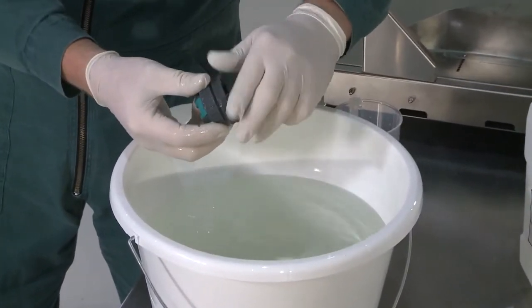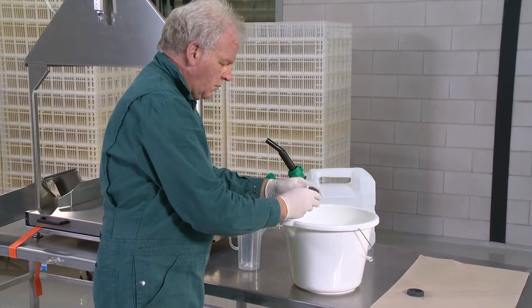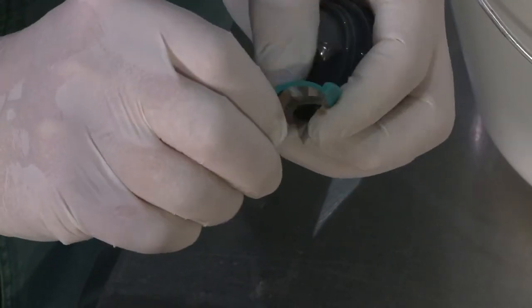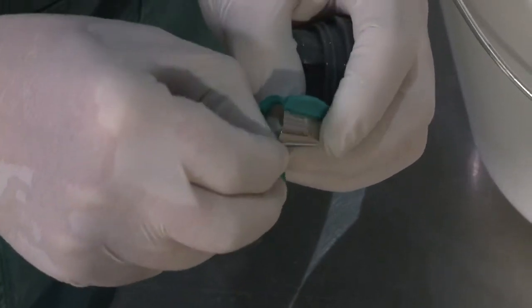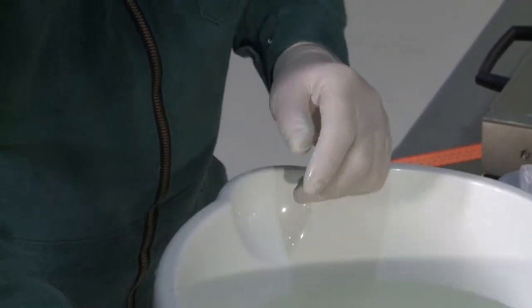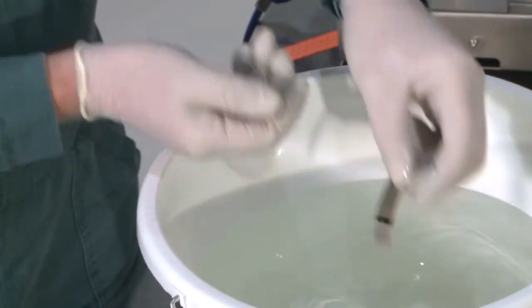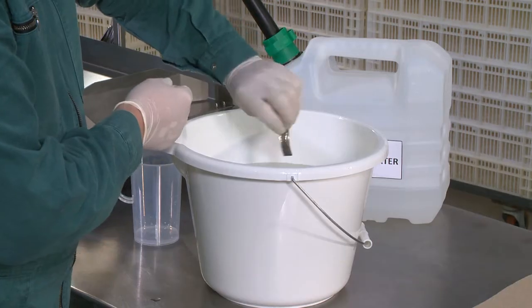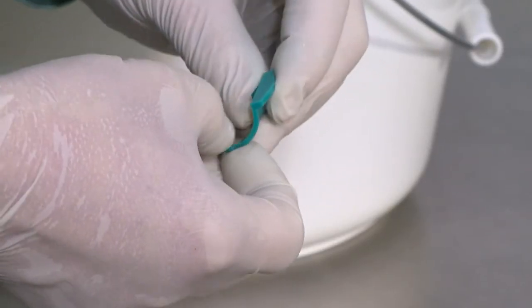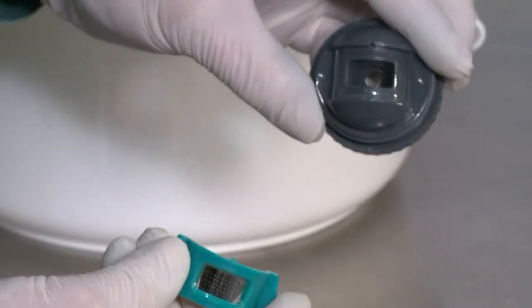To replace or clean the inside of the spray nozzle, unscrew the spray nozzle from the Nobilis spray. Unscrew the cap nut from the spray nozzle, separate the spray membrane from its casing and take it out. Remove the black sealing which holds the spray membrane in place. Replace the spray screen by a new one or clean it with demineralized water. Dry it with pressured air. Thereafter, place the spray screen back into the nozzle and reassemble all parts in reverse order.